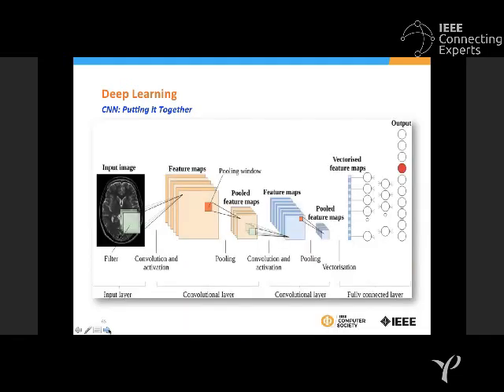So putting it all together, this is the picture. This shows what I'm trying to do. The entire medical image will be decomposed into patches, and the convolution kernels will try to extract the features based on the filter I'm applying. There can be a series of convolution filters extracting different types of features, and the feature outcomes are slowly and steadily being massaged with the pooling layer and the next convolution layers, and ultimately we have a sort of vectorized feature map.